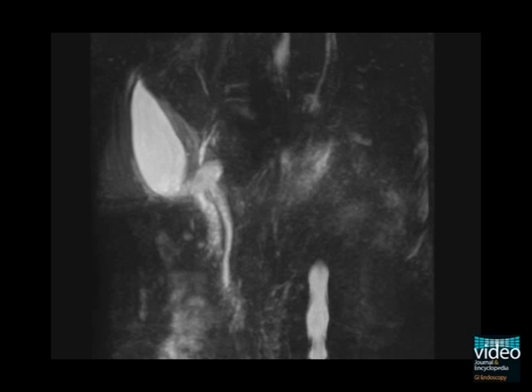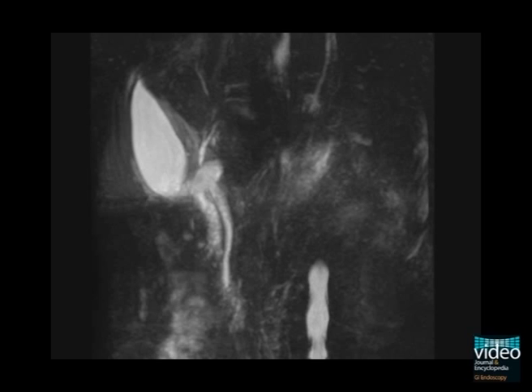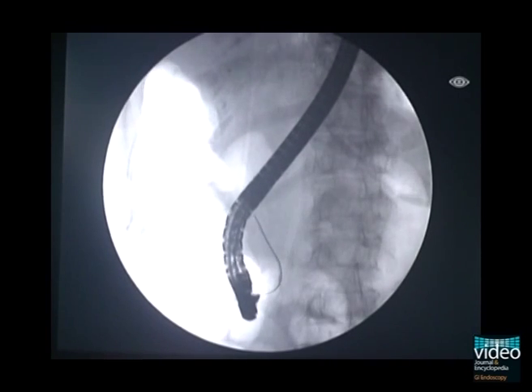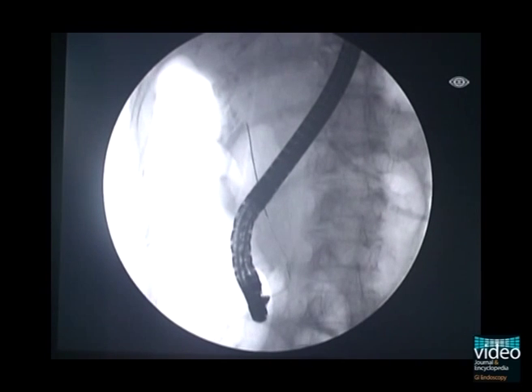Because of a high operative risk and the patient refusing surgical operation, we planned to perform endoscopic gallbladder drainage.